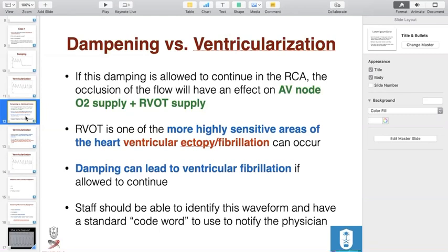And as a fellow, it happened to me. I'm pretty sure anyone who does a lot of cath, the same concept happens. And then you have to react fast. You have to take it out, not panic, and react accordingly. But usually, if you recognize it early and avoid this happening, you're on safe ground. So that's why when it happens, you have to keep an eye.